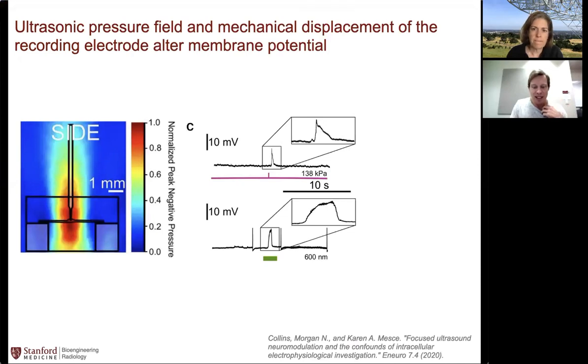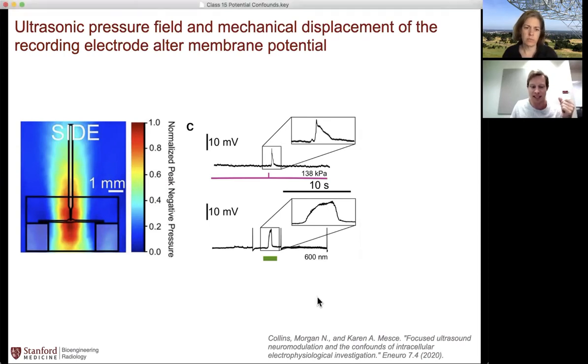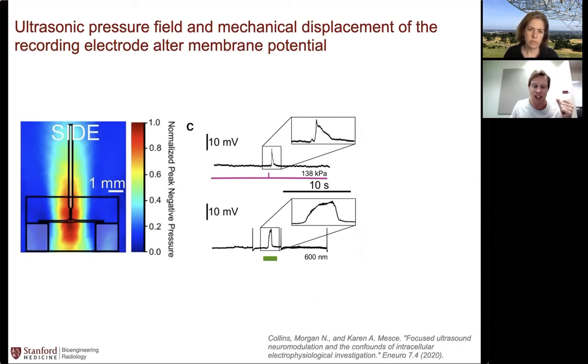So again, we're being critical, and we're just showing you how this work may or may not be useful. So what they did was to ask the question, if the electrode moving from the ultrasound is responsible for at least some of the ultrasound measured changes in electrical activity, then moving the electrode should give us a similar readout. So on the top here, the pink line is showing you a short pulse of ultrasound on. That's where that line kind of ticks up. And you can see the electrical response of the cell. It's sort of a sharp upswing, and then the signal decays back down.